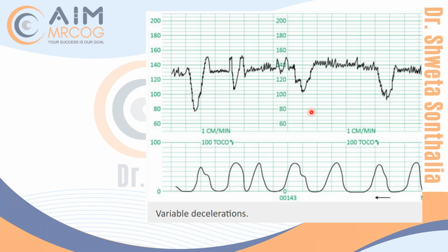What could be the reason? She told me that you are labeling and categorizing the CTG wrong. If it is early, there will be no problem to the baby. Then I thought retrospectively that maybe I'm confusing some other deceleration with early deceleration. Then I went back to my clinical practice, applied that knowledge, and realized that when there is cord around the neck, the variable deceleration comes always with contraction, and we are labeling it as early deceleration, but actually it is not.